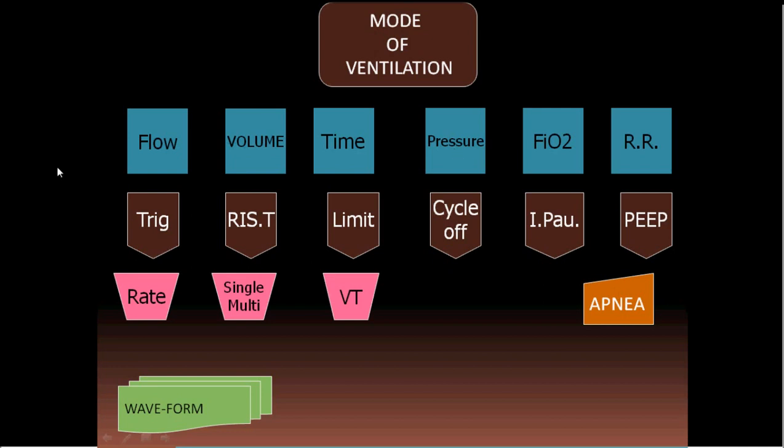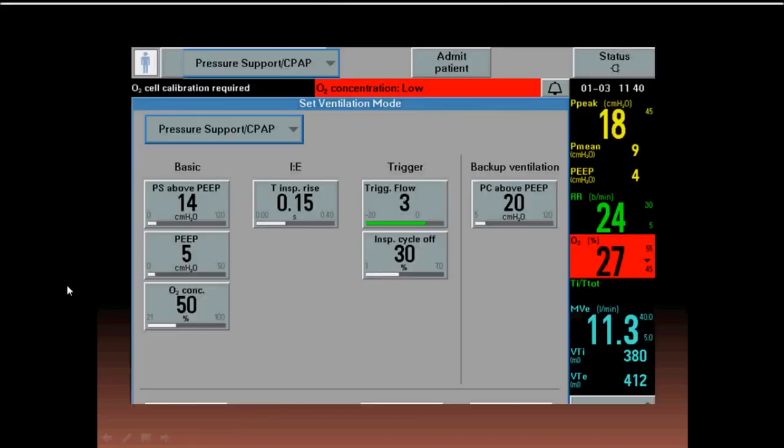Apnea, for this is a spontaneous breathing, so we should put a backup mode, which is apnea mode in the form of a pressure controlled mode, and there is no sigh. The waveform is decelerating for sure.